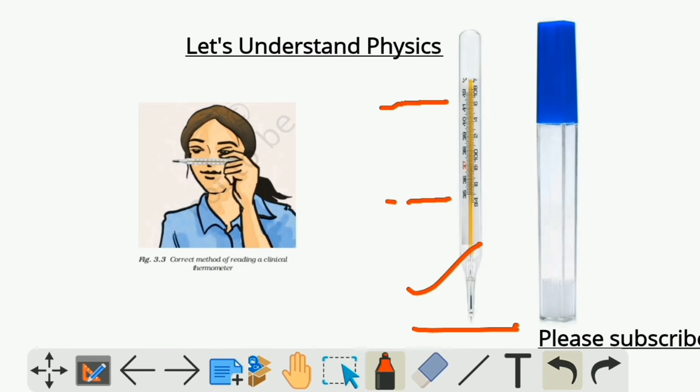Can you use it to measure hot water, boiling water, hot milk, or any substance which is very hot? No, you should not use this. There may be a chance of breakage of the thermometer, because water can boil up to 100 degrees Celsius. But what is the range of the clinical thermometer in degrees Celsius? Only 35 to 42. That's why it should be used only for human beings.